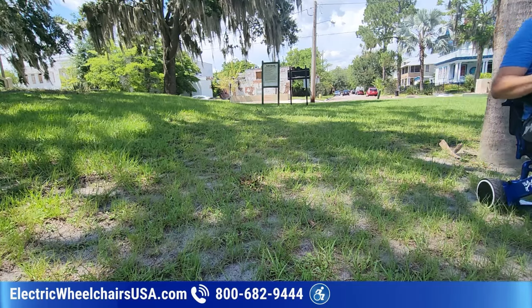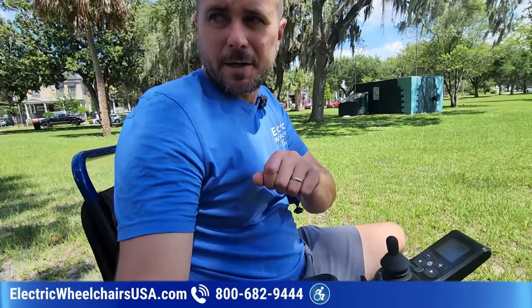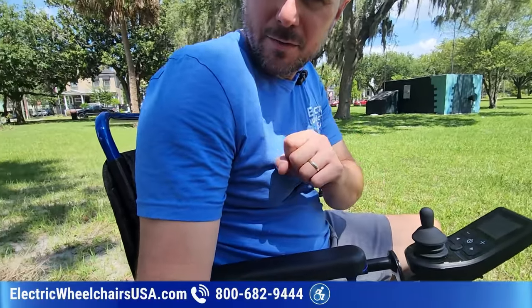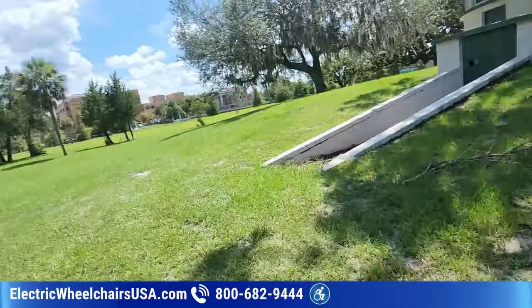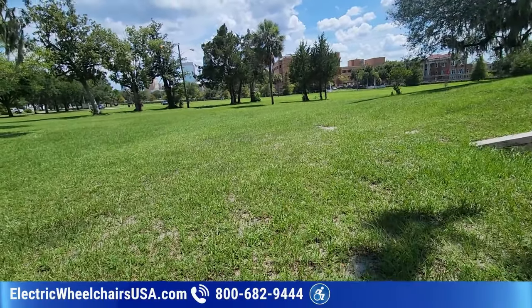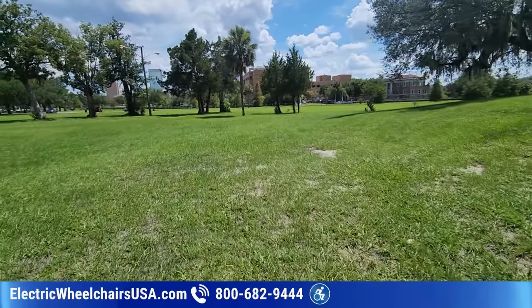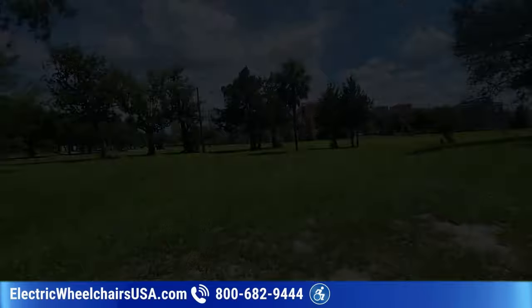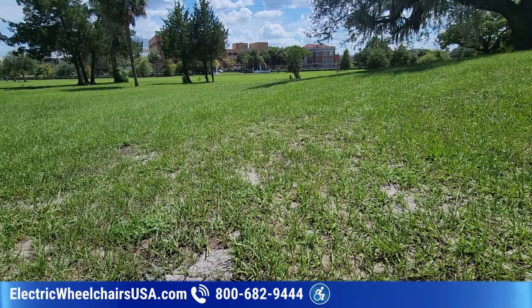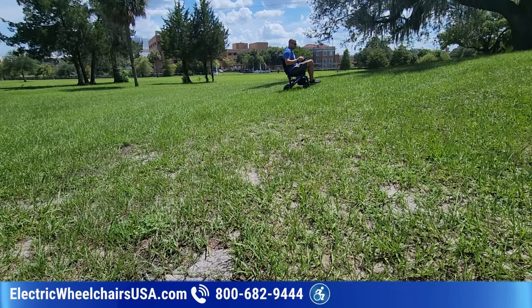This wasn't really a great place to test it, just because there's some little divots and holes in the ground right there. But this grass over here is a little smoother. So I'm going to try it on here, and I think you'll be able to see if it can handle that incline a little bit better. So let's try that out. Yeah, so this is a little smoother grass wise. I don't see any little holes in the ground. So yeah, I can go right up. Look, it powers right through this really easily.